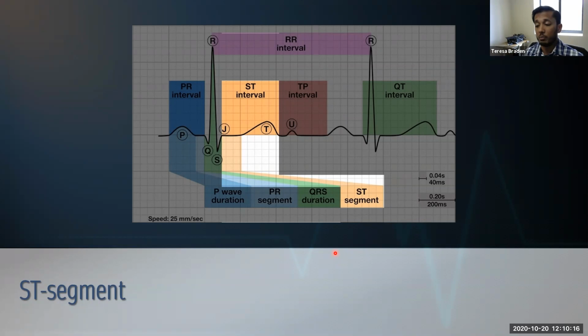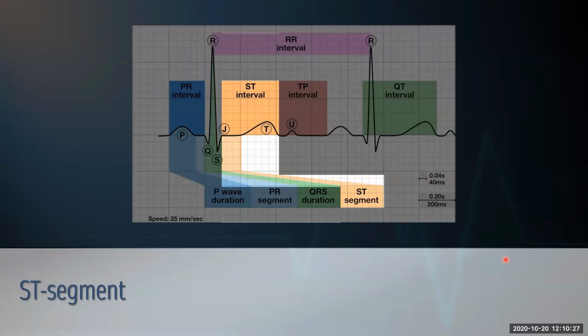So that's why, like you mentioned, Dr. Long, it is important to be able to measure on your own, but even just looking at the EKG, because that computer is definitely going to be fooled multiple times. So hopefully that answers your question. Thanks. Yep. All right, so let's look at the ST segment.